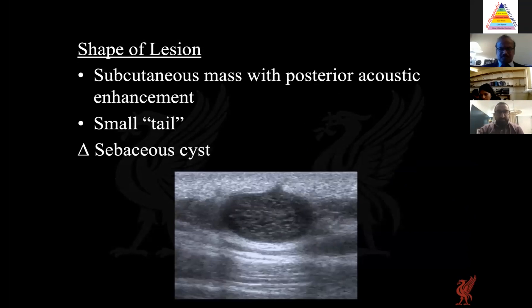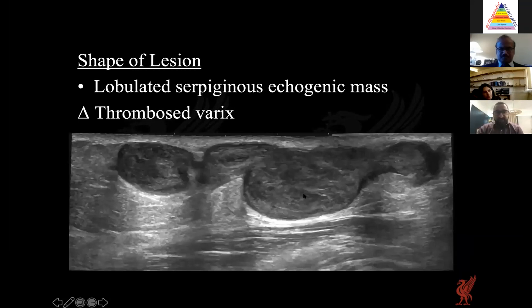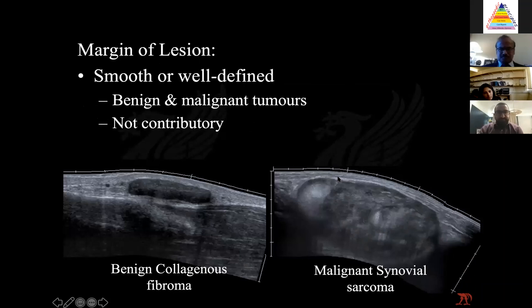Shape of the lesion is helpful. One case showed a very well-defined lesion with a tail going up to the dermis — combined with other characteristic features this helped diagnose an epidermal cyst on ultrasound. Another example where shape is very characteristic is that of a thrombosed varix — a lobulated snake-like lesion continuous with a vein, diagnosed as a thrombosed varix on imaging alone.